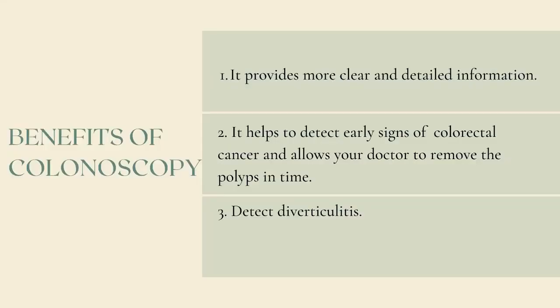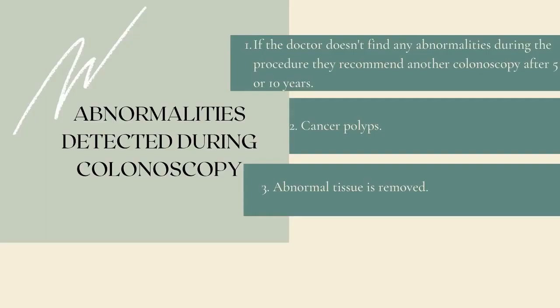Next, we are going to discuss the benefits of colonoscopy. Colonoscopy provides more clear and detailed information. Colonoscopy helps to detect early signs of colorectal cancer and allows your doctor to remove the polyps in time. It is also used to detect diverticulitis. Over time, bacteria and food can build up inside the pockets of your intestines, leading to painful inflammation and also the infection known as diverticulitis. These are the benefits of colonoscopy.